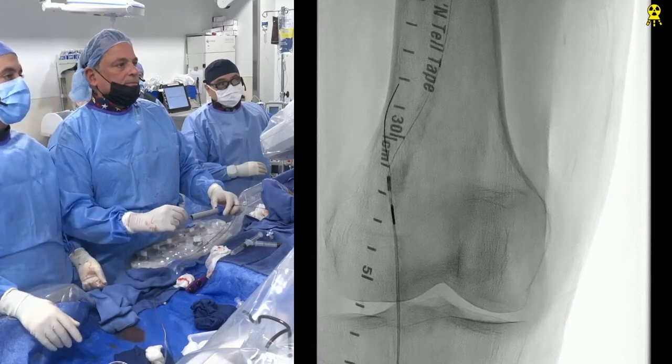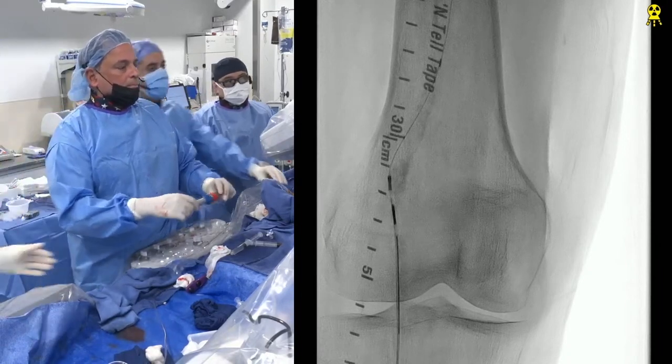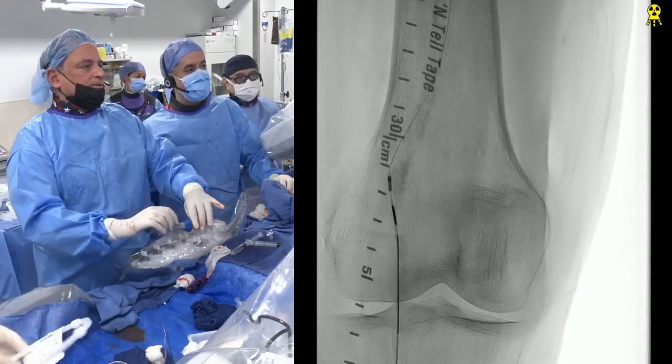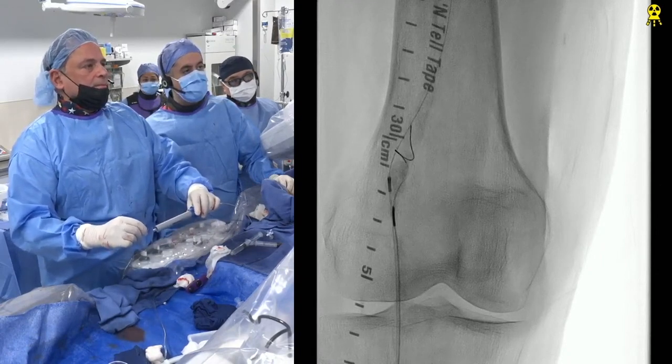Same problem. You want to fire your needle a little bit? I did. Oh, you did? Oh, okay. I didn't see that. So maybe we'll just turn directions and try to see if we can. Hold on. Let me turn the direction here. Exactly. Nope. The other direction. Let's try there. There's the needle right there. Might give you a better plane.